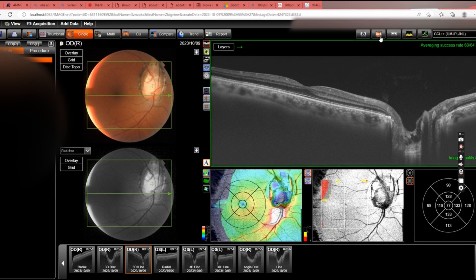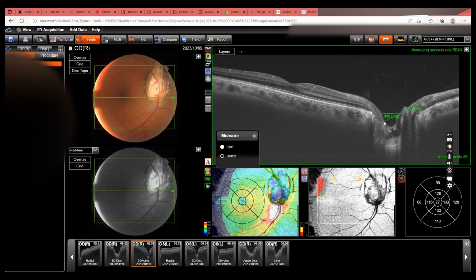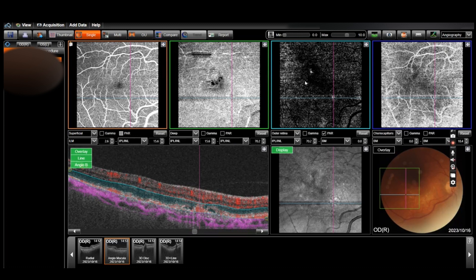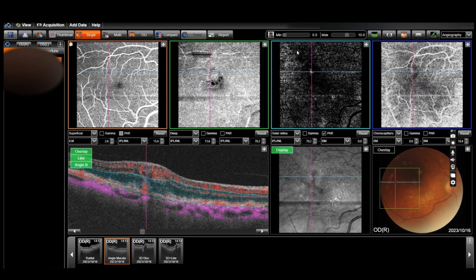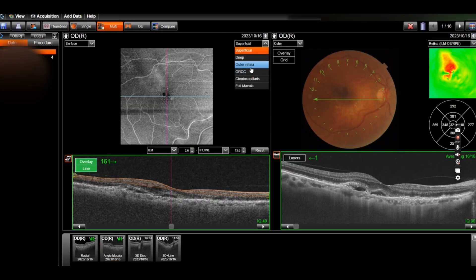This is ImageNet — the program in which you are supposed to view the images. It offers more functions; for instance the caliber option, and OCT angiography. You cannot review OCT angiography in the dry Triton software, but here you can. Naturally we see OCT angiography and below we see en face OCT on different layers depending on the segmentation. Another view is the traditional view: a fundus photo, the B-scan with flow, and also some sort of en face.